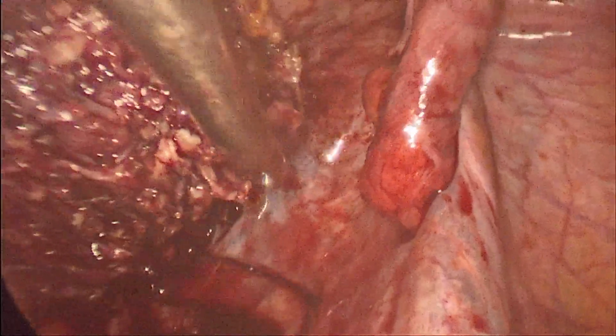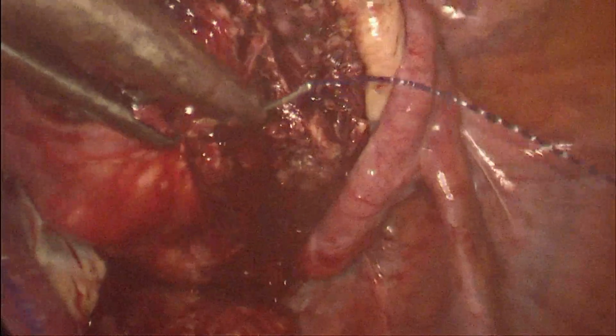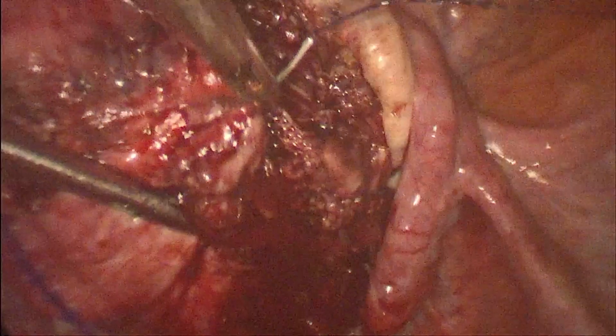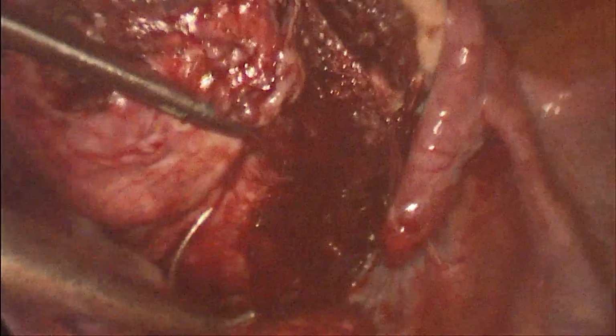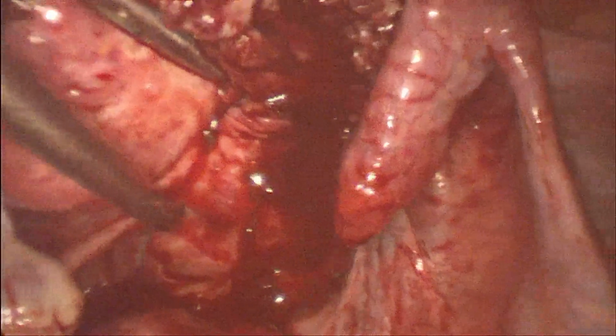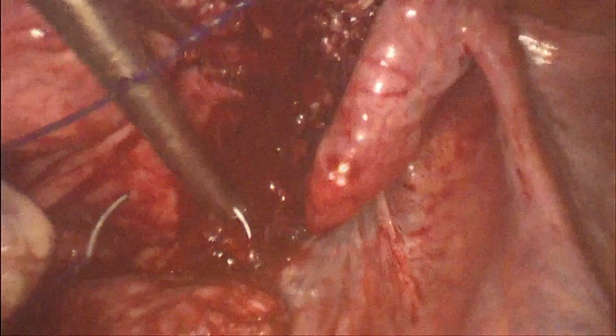In such a situation, barbed sutures become very easy to handle, and maintain good hemostasis at the end of the surgery.